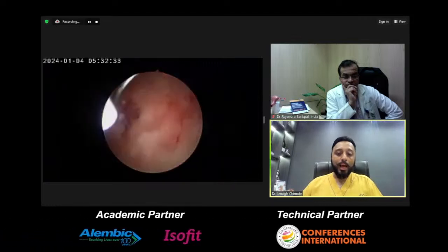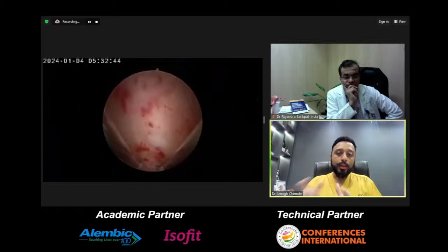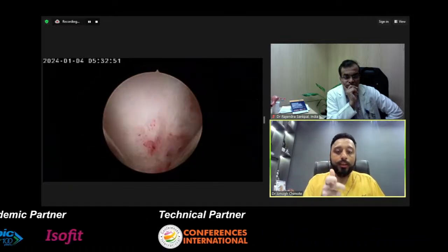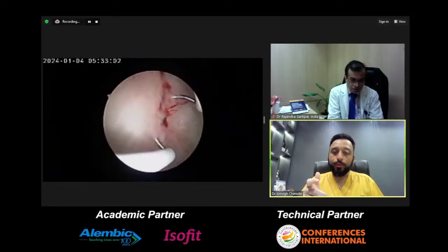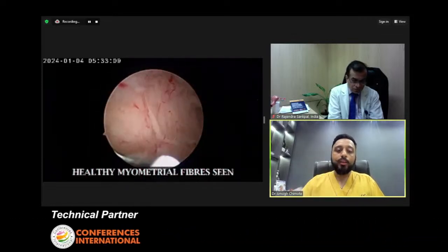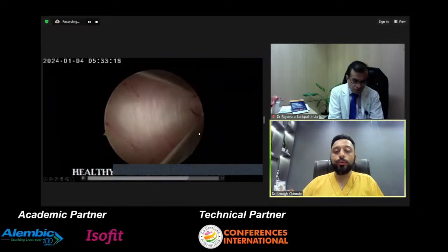So here I am using the resectoscope actively. Although we have a passive resectoscope where we pull in the tissue, here I am pushing in the tissue because I am not using any energy. It is safe to use it. Although this is an obstetric case and the pregnant uterus is very fragile, you have to be careful not to apply a lot of force. Just gentle scraping is done.